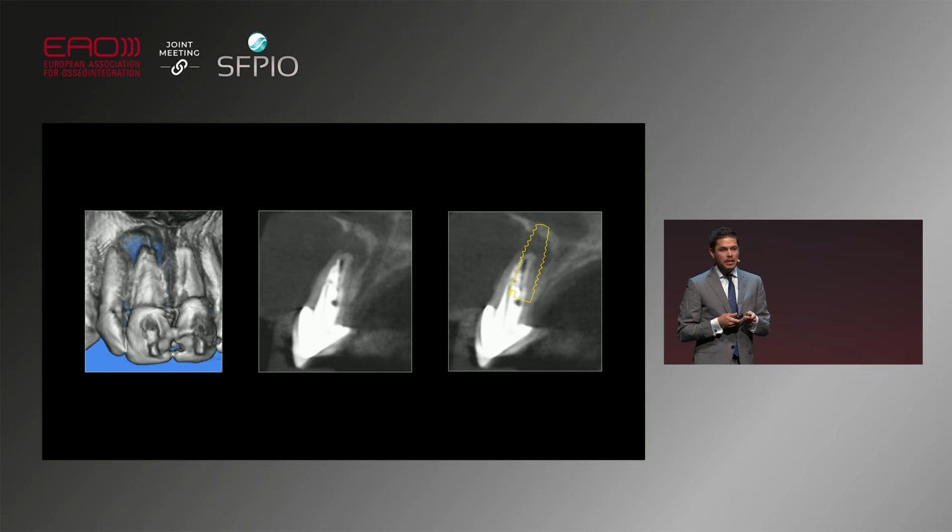And obviously, you could ask me, can you stabilize this implant? Can you go and anchor this implant here? Maybe. Do I want to do that? Do I want to complicate my life to such an extent? Absolutely not. Absolutely not. I don't want to take these risks.